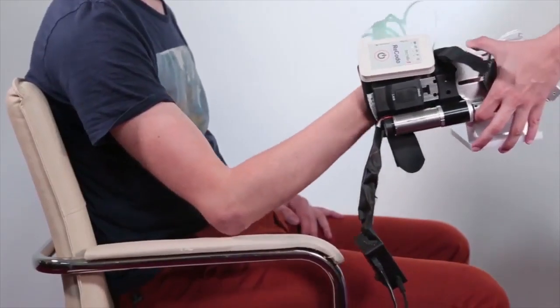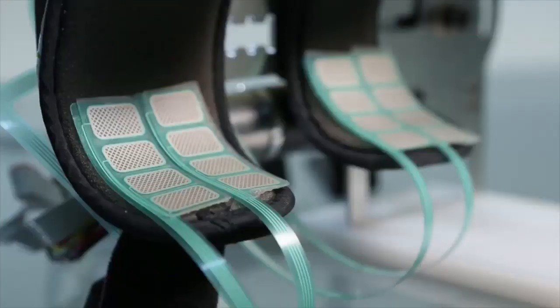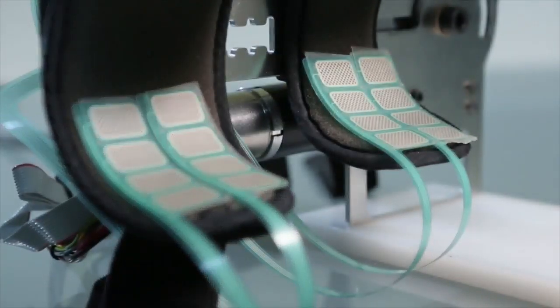ReCodo is simple to apply. Embedded multi-pad electrodes enable semi-automated location of the motor points of the triceps muscle.